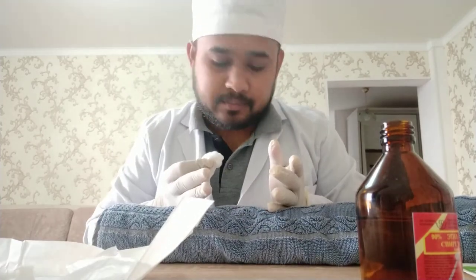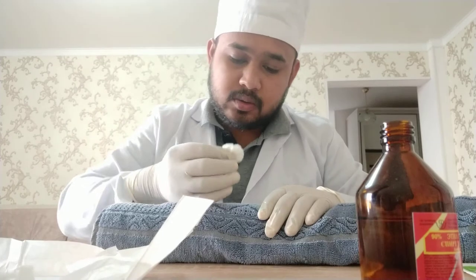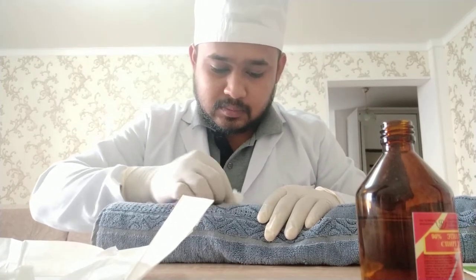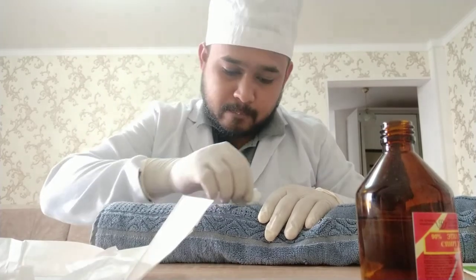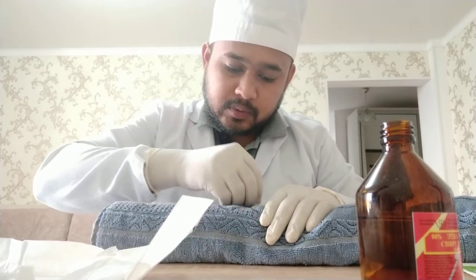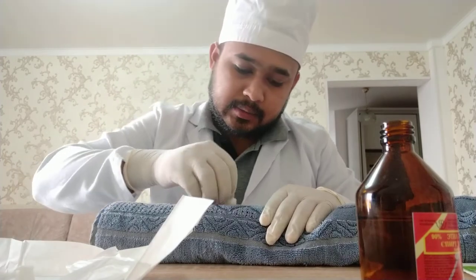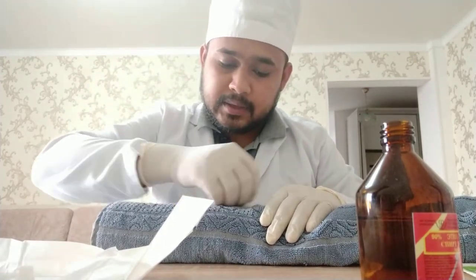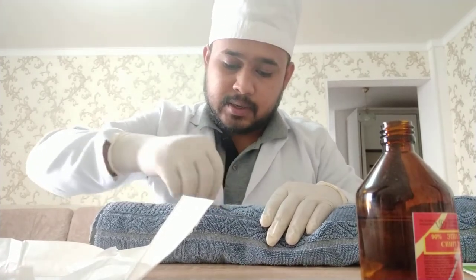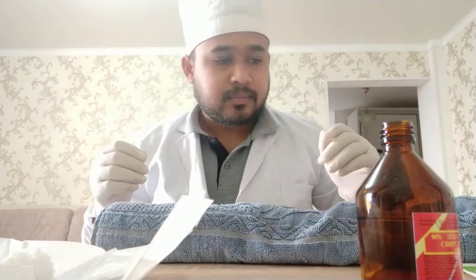In the cubital vein — not popliteal. So I will disinfect the area very widely: first of all in a horizontal movement from up to down, and then in a vertical movement, and then circling — just elaborate the area. Now it's fine, now I have disinfected the area.